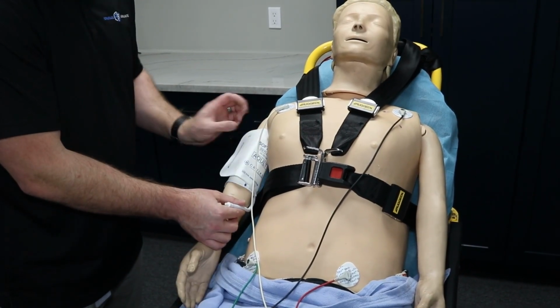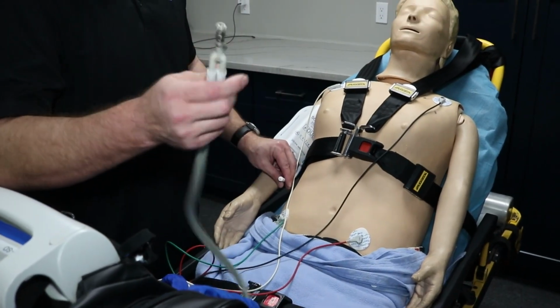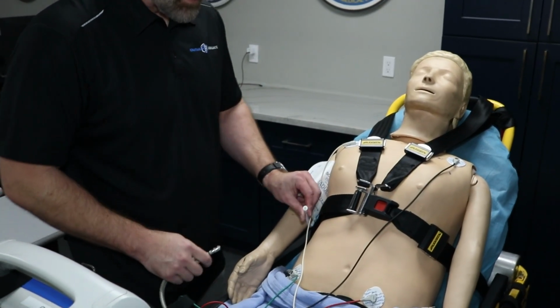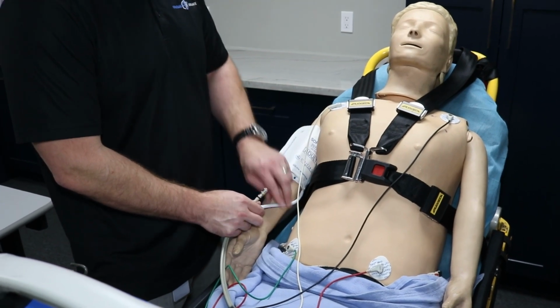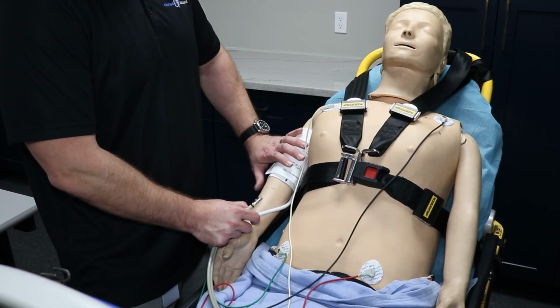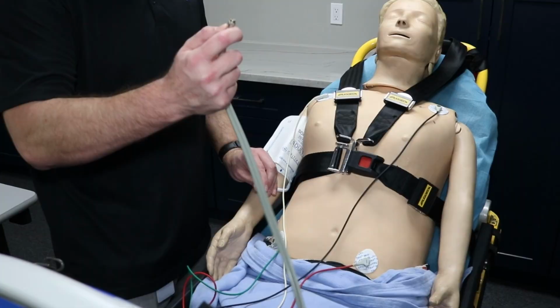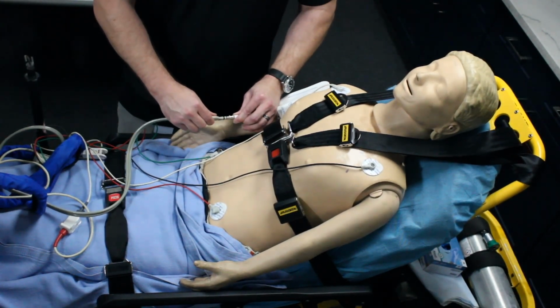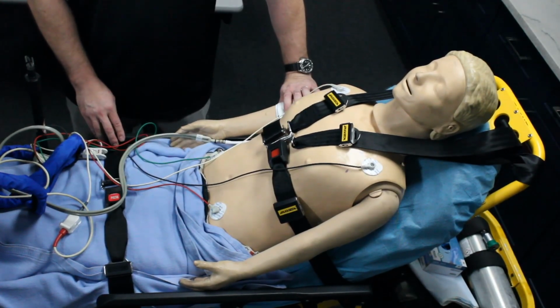And then we're gonna take our quick connect on our blood pressure hose here. This is a quick connect utilizing the single port quick connect. If you end up having a BP cuff that has the dual prong quick connect, we will need to switch that out for a blood pressure cuff that should be in your monitor bag that utilizes the single prong. This guy will attach just by pushing in, connecting, and give it a little tug. Make sure that it's not going to pop off. So that is good there.